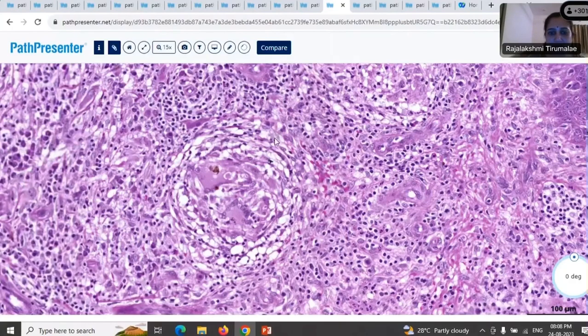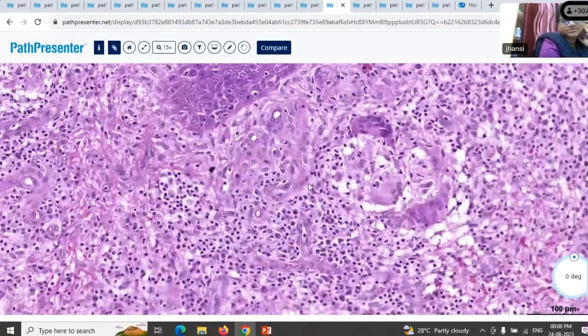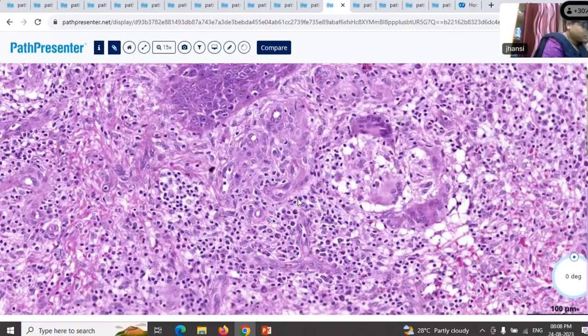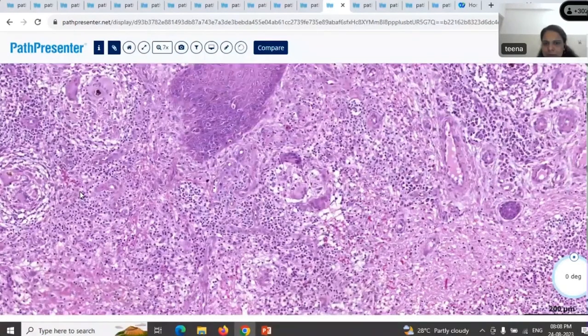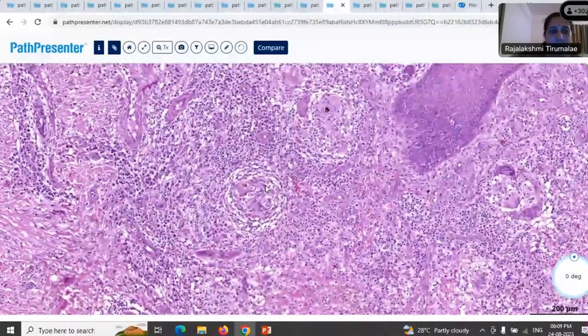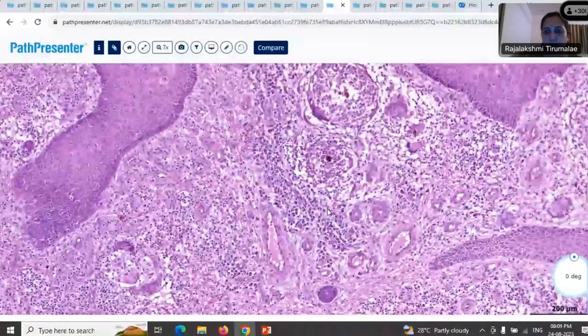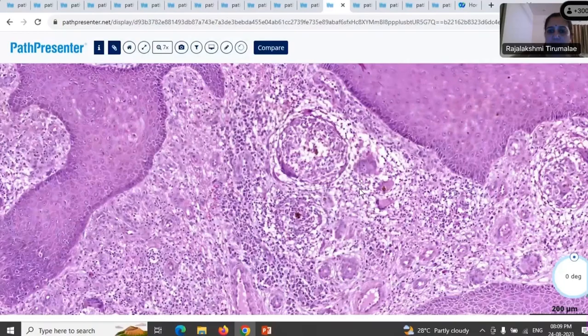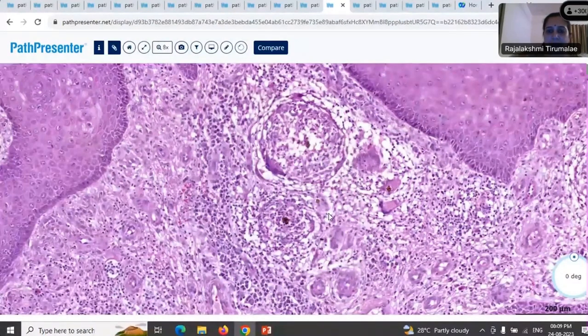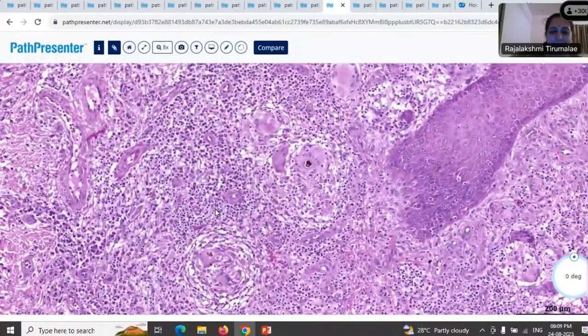But what are these cells? Epithelioids. There's more of that here. They are epithelioid cells, isn't it? So these are epithelioid granulomas that you're seeing. And you have a cuff of lymphocytes around some of them; some don't have too many lymphocytes. So this is an epithelioid pattern of a granuloma. And you rightly said there are several giant cells. Anything else which is striking in this case?